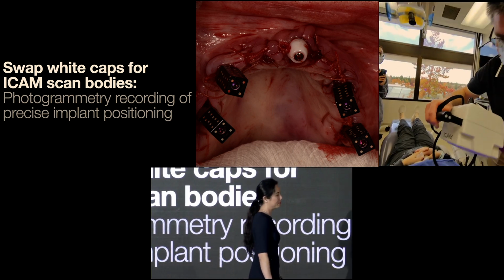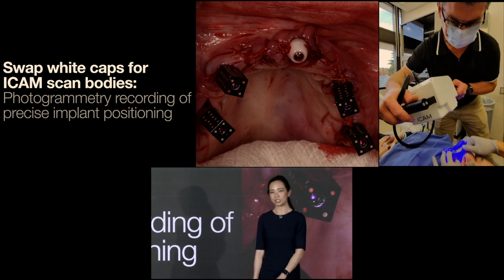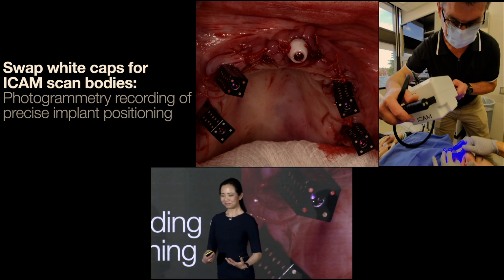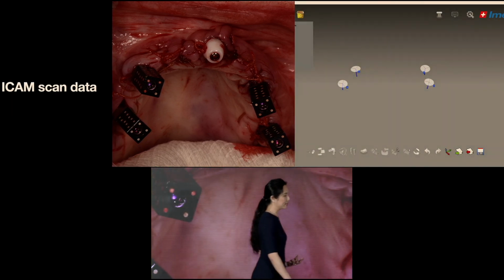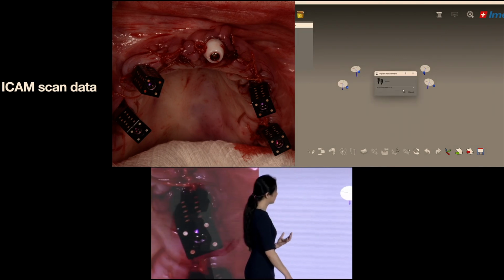This video is being done in real time. Upon seating the scan bodies, the scan itself takes about 50 images, so it's about 30 to 45 seconds from start to finish. And once we have that data, this is what it looks like. And that's the reason why we needed a soft tissue scan, or soft tissue relationship.